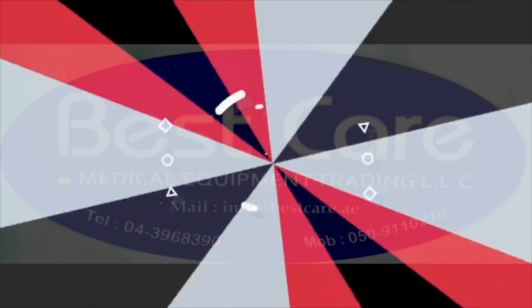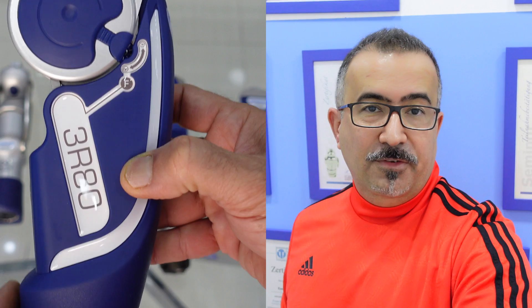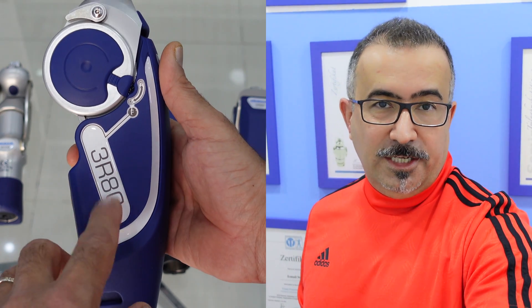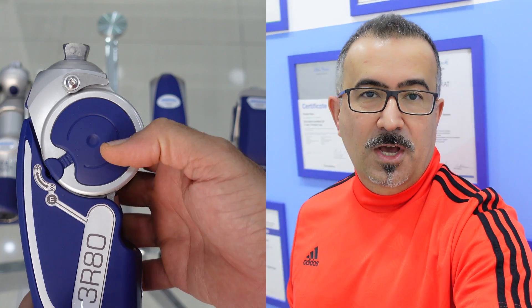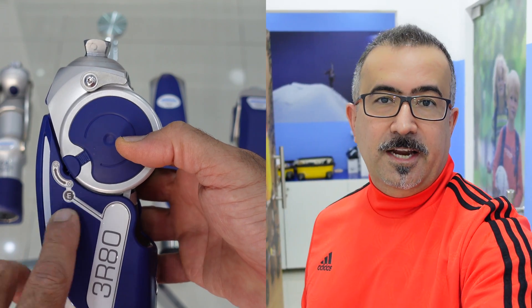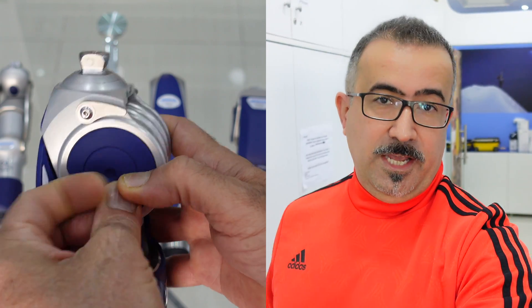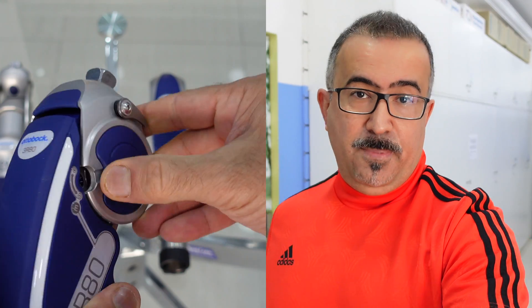Welcome to BestCare Medical in Dubai. In this video, I will explain to you about two Ottobock knees: 3R80 and 3R106. Now you will see the video about 3R80. After that, I will explain to you about Ottobock prosthetic knees.